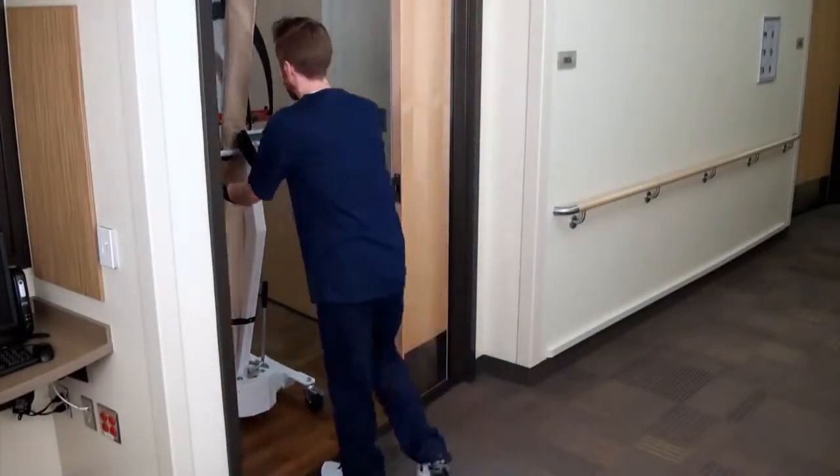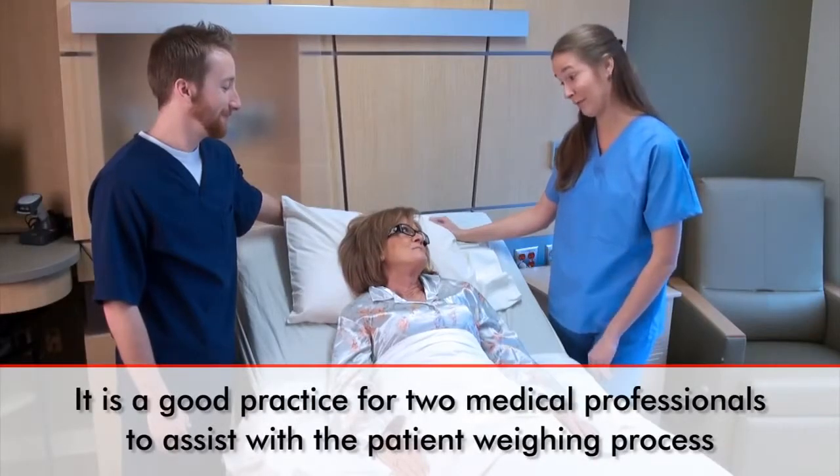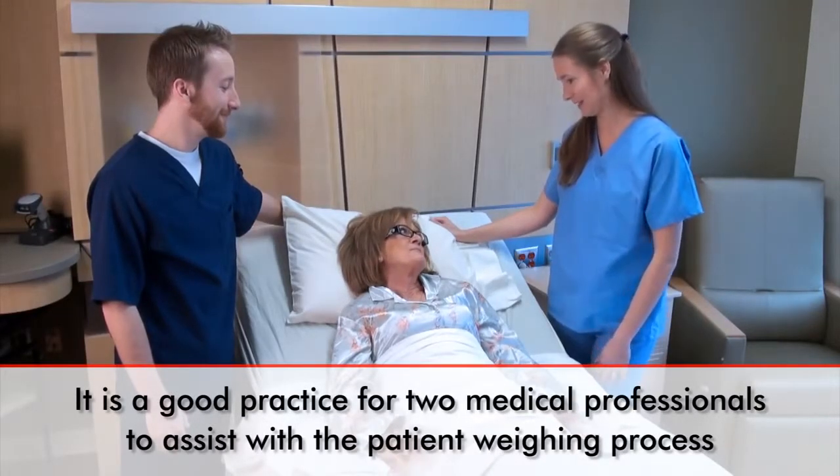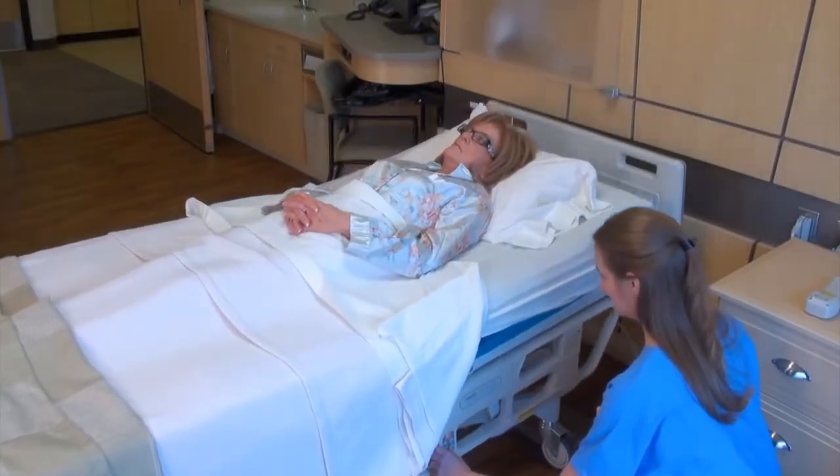Keeping the wheel stance narrow, move the scale into the patient's room. It is good practice for two medical professionals to assist with the patient weighing process. The patient must be lying flat in bed before the weighing process can begin.